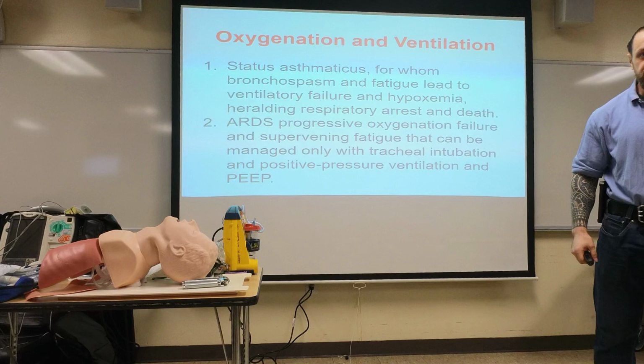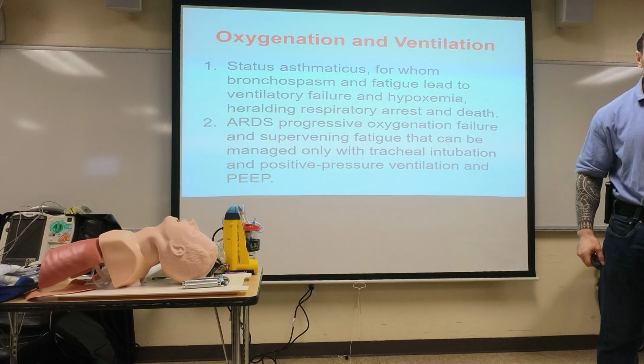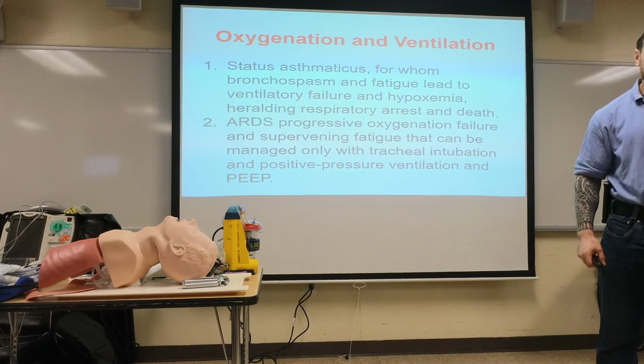We call it type 1 respiratory problem. So the reason we're intubating them is not to protect or maintain the airway. The reason we're intubating them is because what? Because they have failure to oxygenate. You follow what I'm saying?